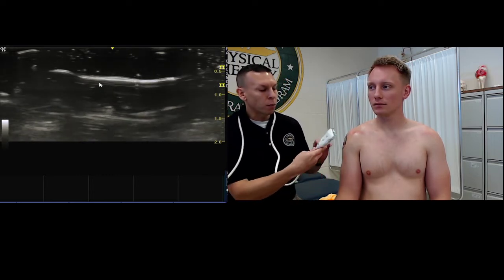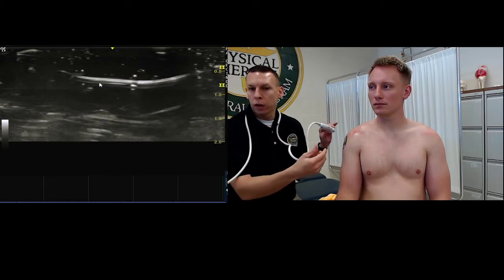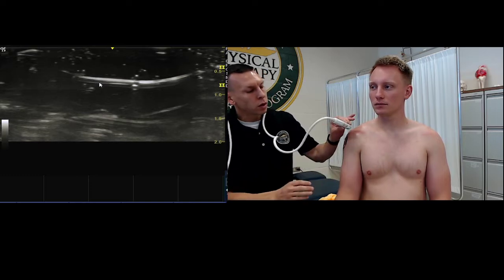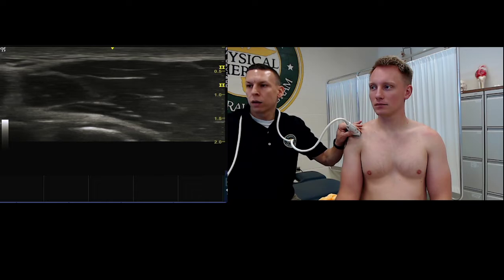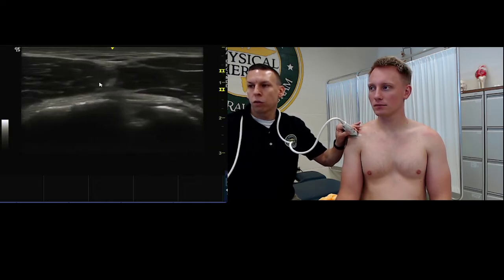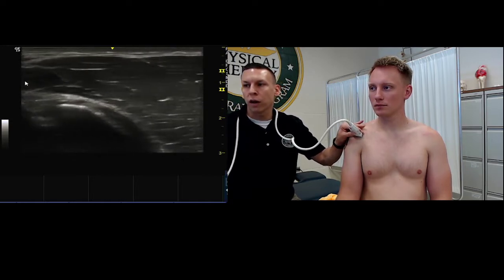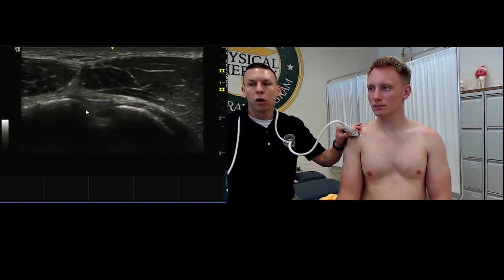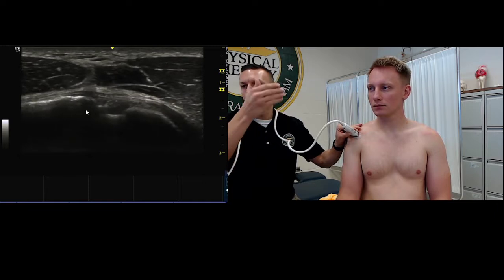We're going to take our probe, and we're generally always going to start with the indicator short axis towards their right shoulder. Now when we do that on the screen, just keep in mind, I'm going to change my depth a little bit here. To the left of the screen is lateral, and to the right of the screen is medial. So whenever you put your probe down, always make sure you know where your indicator is, so you know what's on the left side and what's on the right side.